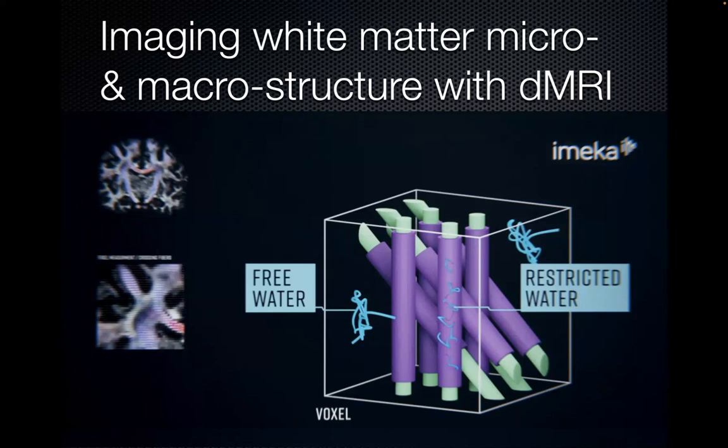We have crossing fibers everywhere. Fibers coming together, but also crisscrossing and traversing to reach cortex. 160,000 kilometers of axons. And so we're going to have water outside axons, the extracellular water. We're going to have water inside axons. And on top of that, axons may be crossing or kissing, right?